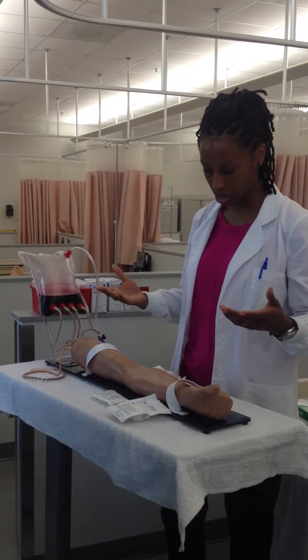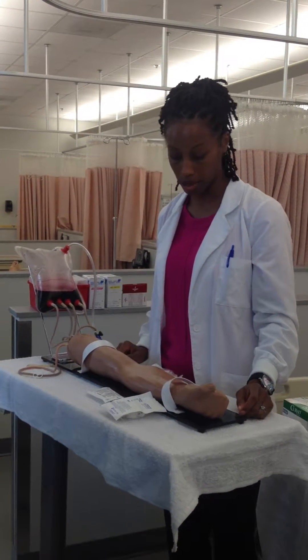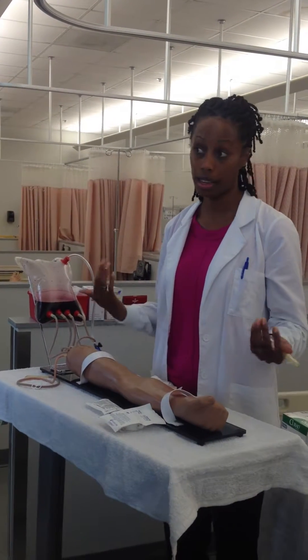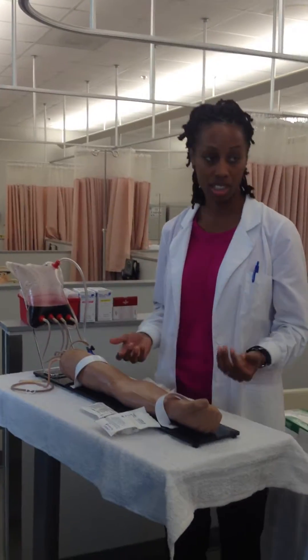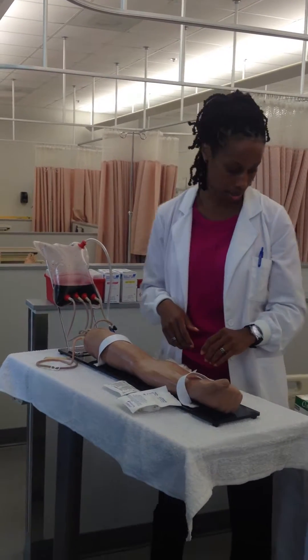So they're going to get everything. After the nurse's assessment, they have a doctor's order. They're going to ask, what hand do you prefer? Patients — a lot of them are good historians — so you want to ask them, where do you normally get an IV site? What are your good sites? And they can tell you, and you kind of want to go based on what they tell you. You also want to go by their hand dominance. If by chance you don't see any veins in that arm, then you just have to go to the arm where you do see access.